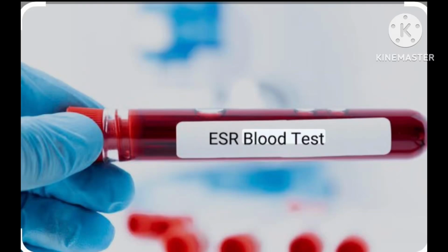Today we are going to cover two very important lab tests, ESR and C-Reactive Protein. These are widely used to detect inflammation, infections and autoimmune diseases. Let's make them super simple. First of all, we'll discuss what is ESR. ESR is Erythrocyte Sedimentation Rate.